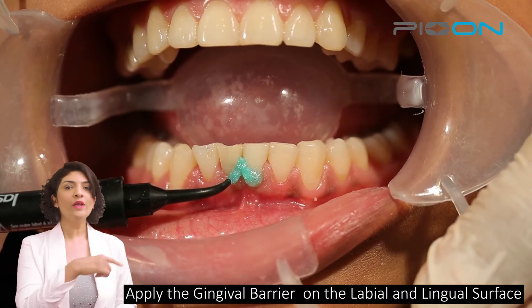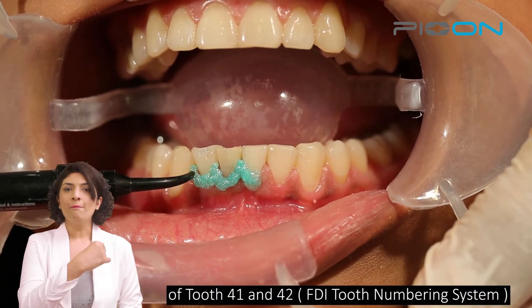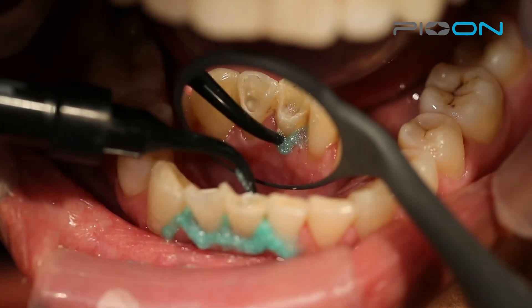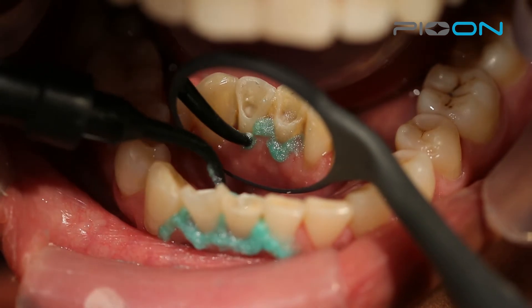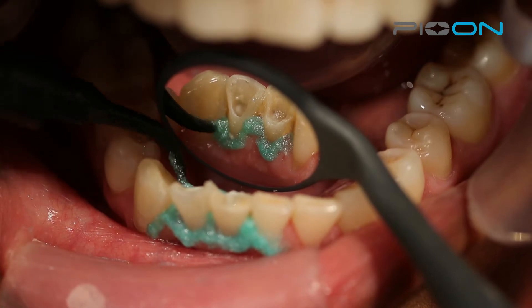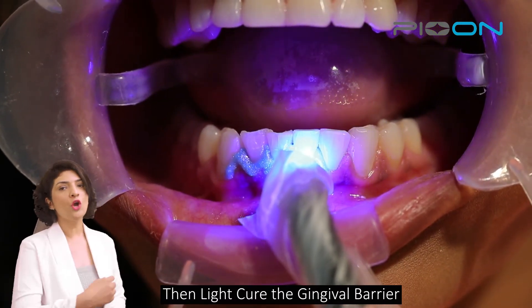After that, we will put gingival barrier both on the labial surface and on the lingual surface, and then we will cure it.